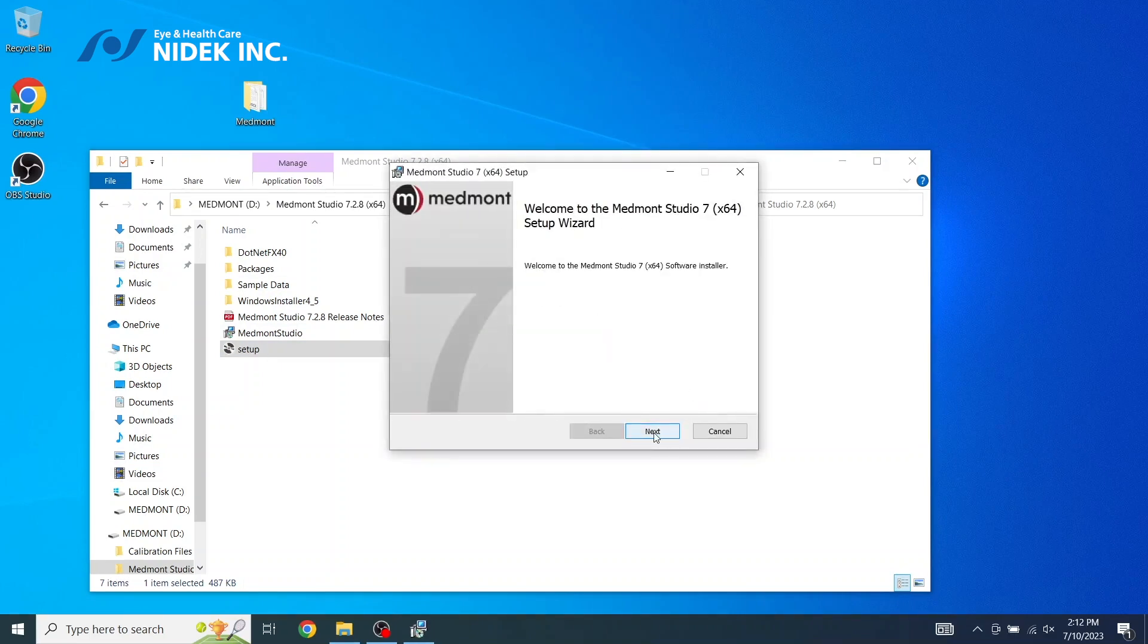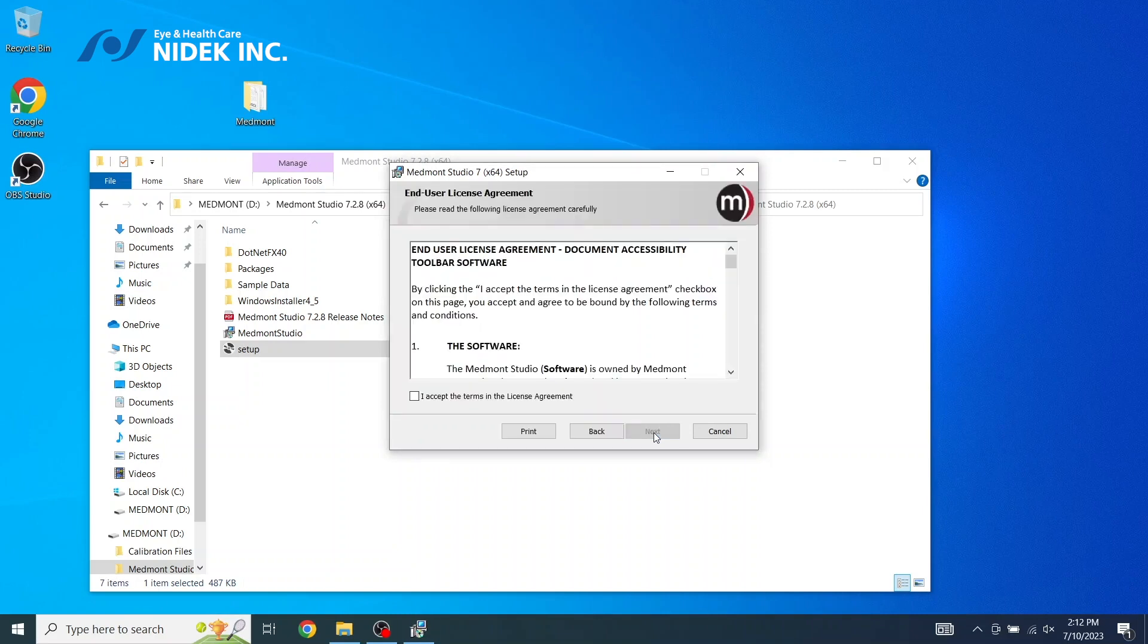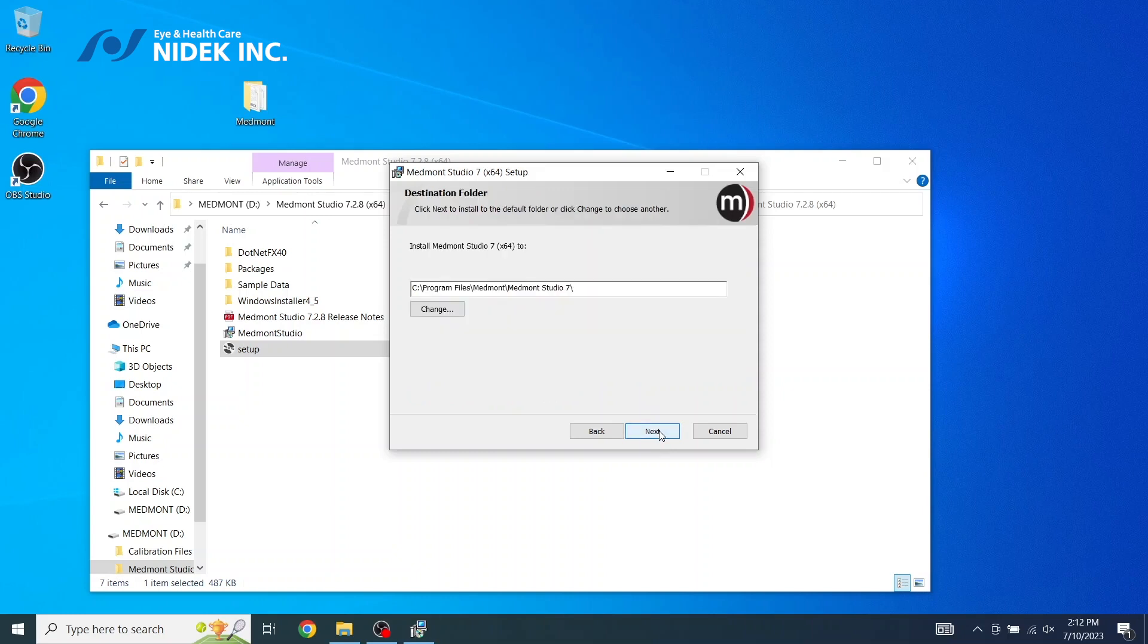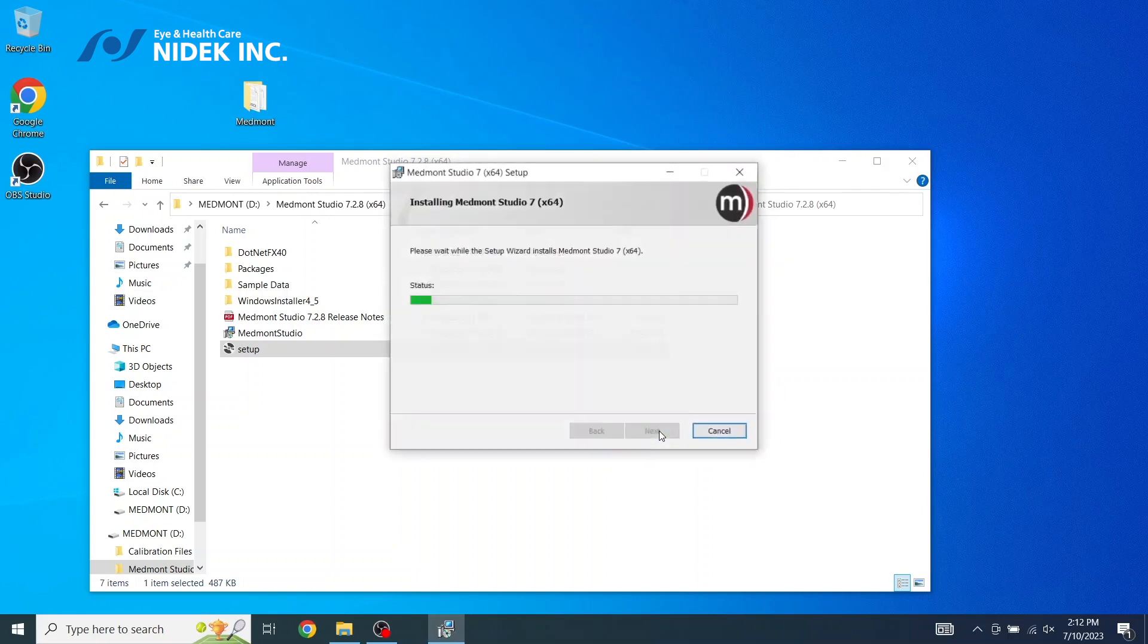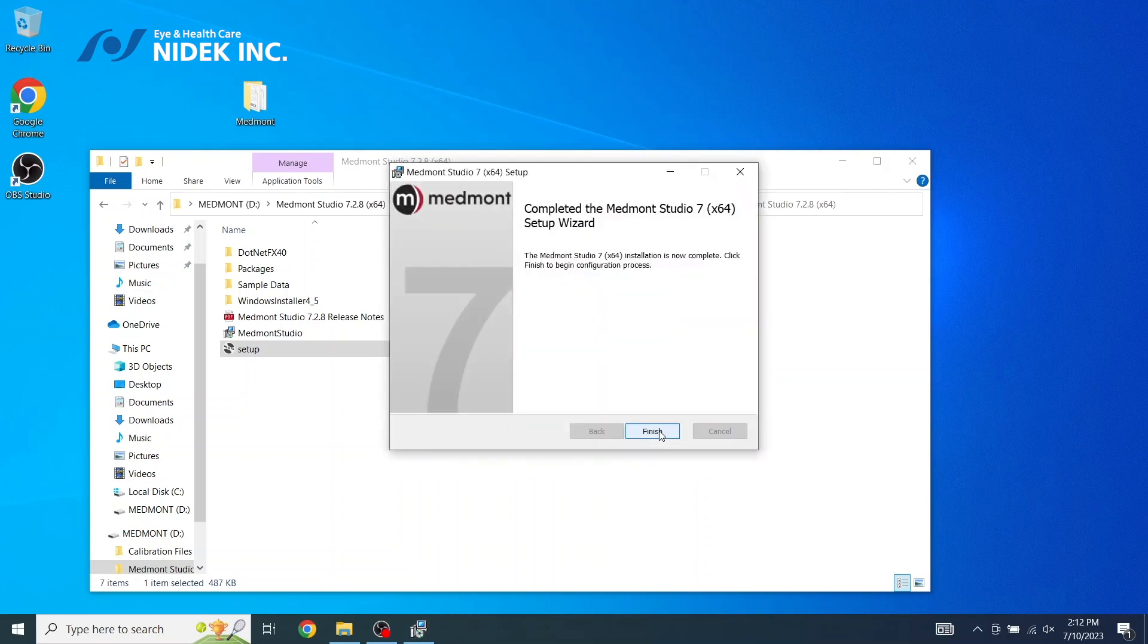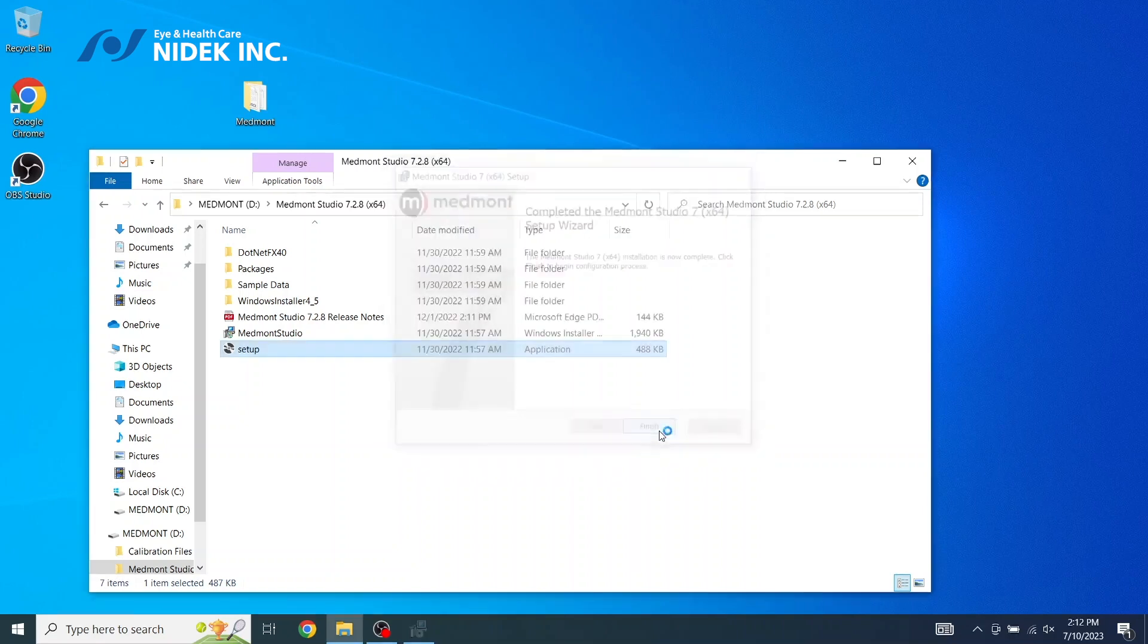Setup wizard, select Next, accept the terms in the license agreement, and then Next. Next, and Install. Select Finish.